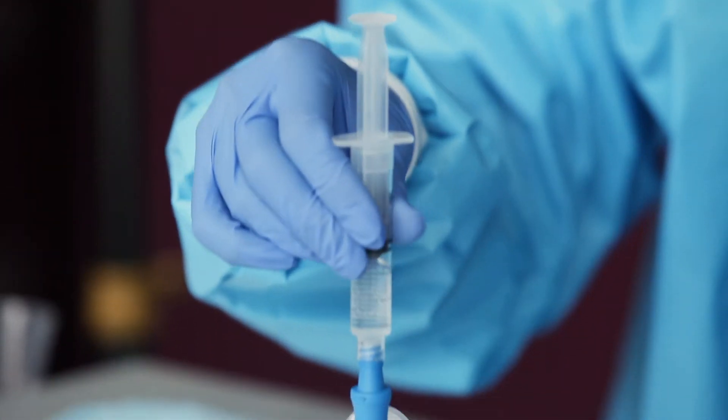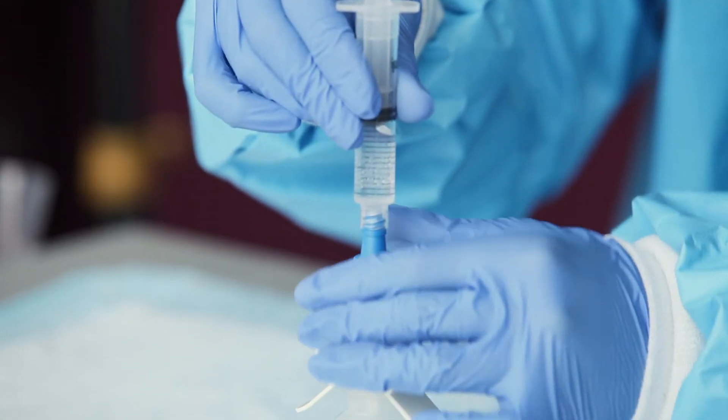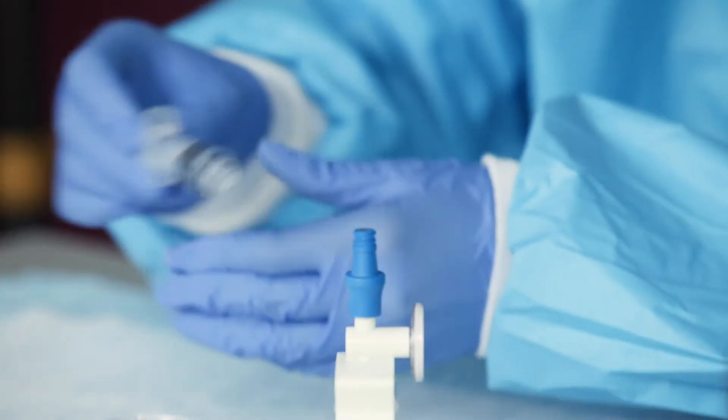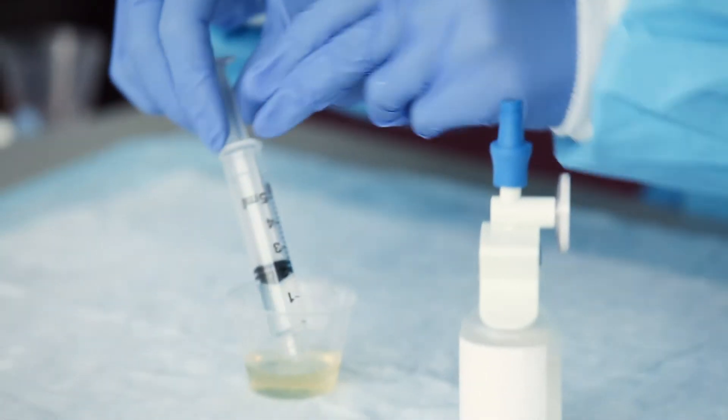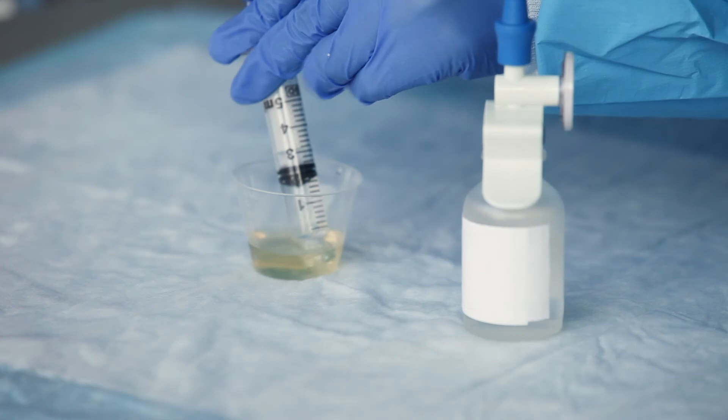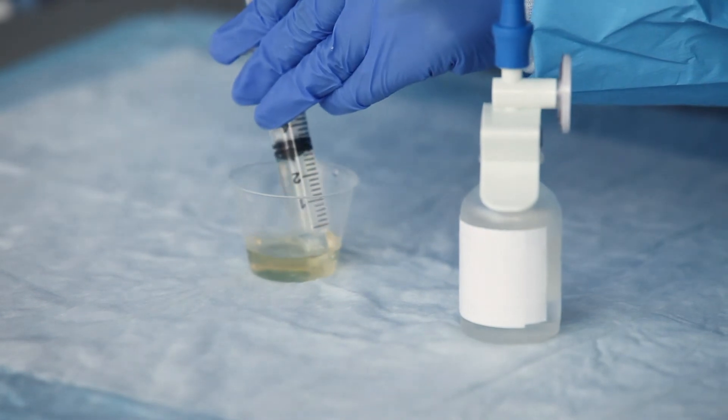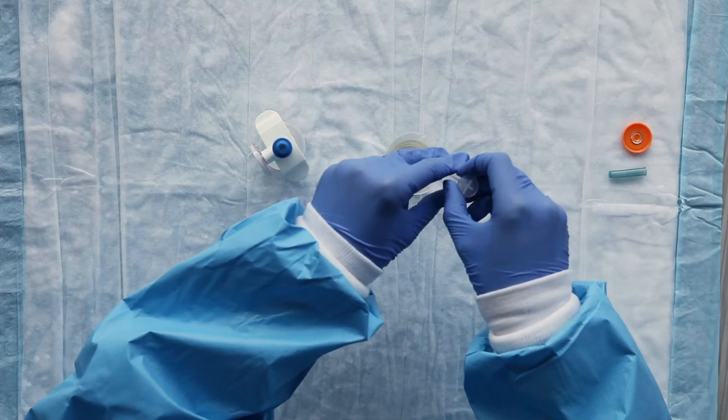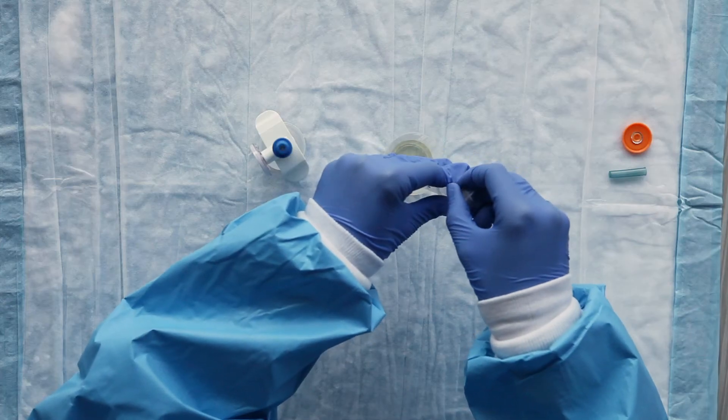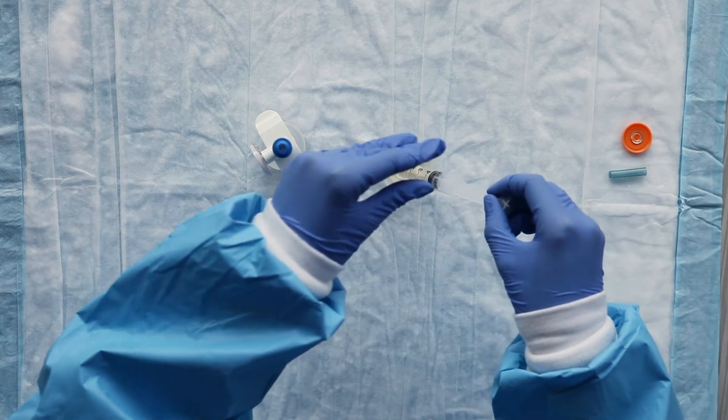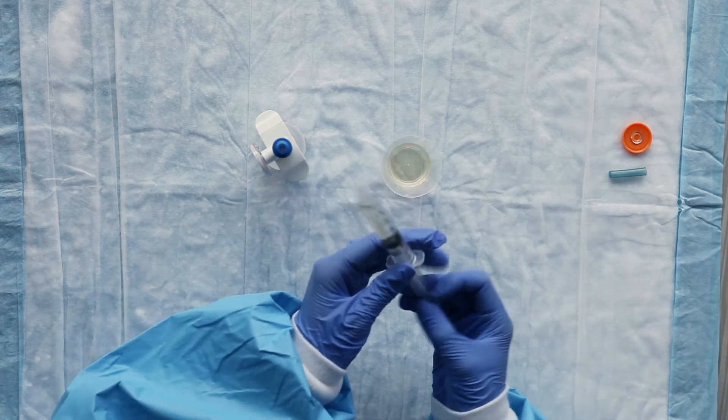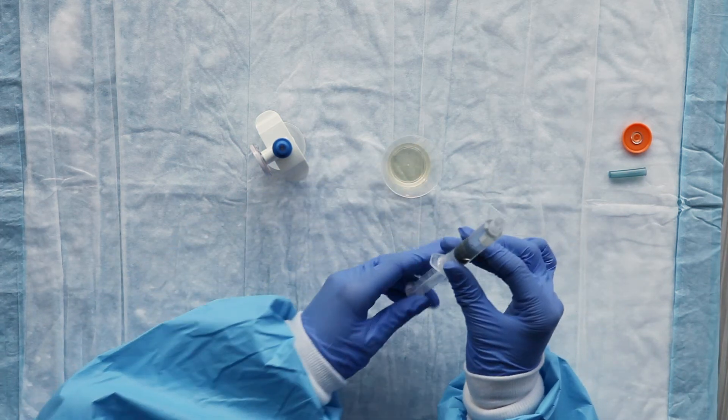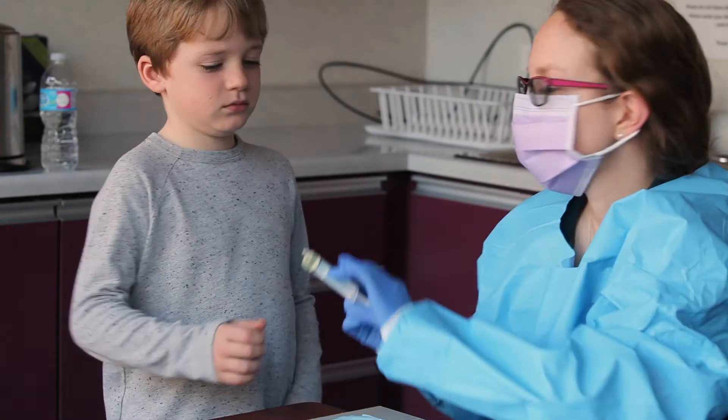You are now ready to mix the medicine. To give the injectable medicine by mouth, you can dilute it in the syringe or mix it with a drink. To dilute it in the syringe, draw some of the drink into the syringe with the medicine and give it to your child. Whatever amount of medicine your child needs, you will need to add at least an equal amount of the drink to improve how the medicine tastes.